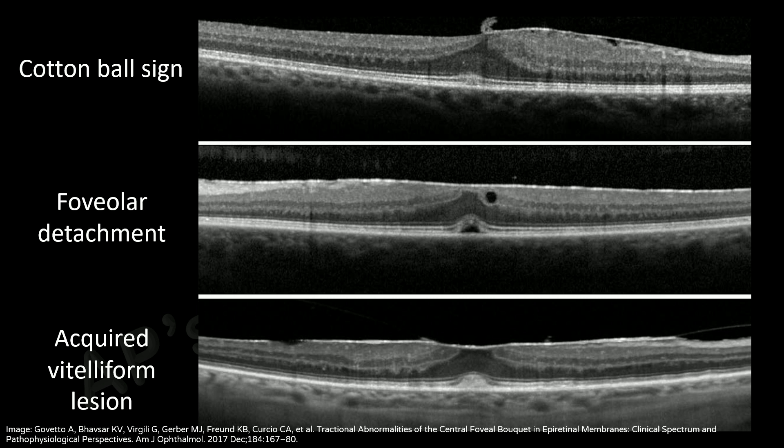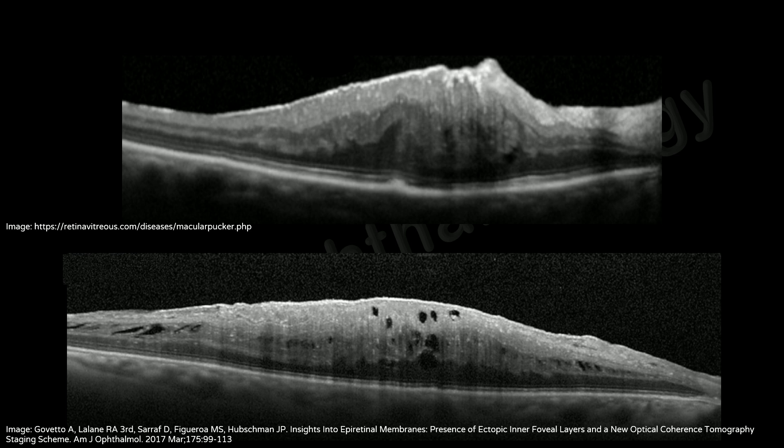The best corrected visual acuity is better in eyes with a cotton ball sign and worse in eyes with an acquired vitiliform lesion. Advanced changes due to traction include ellipsoid zone loss and macular holes. Here are some additional pictures to help familiarize yourself with OCT signs of epiretinal membranes.